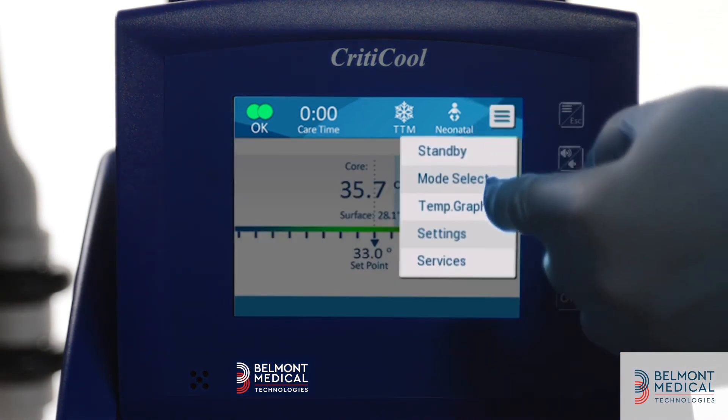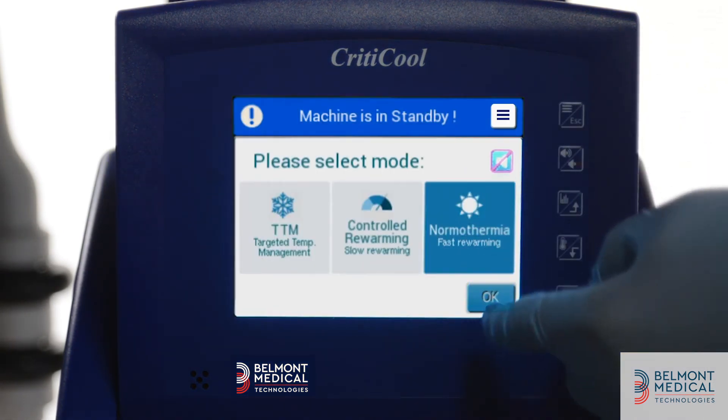Normothermia mode allows you to perform a rapid rewarming. The system will reach the desired temperature and keep it.